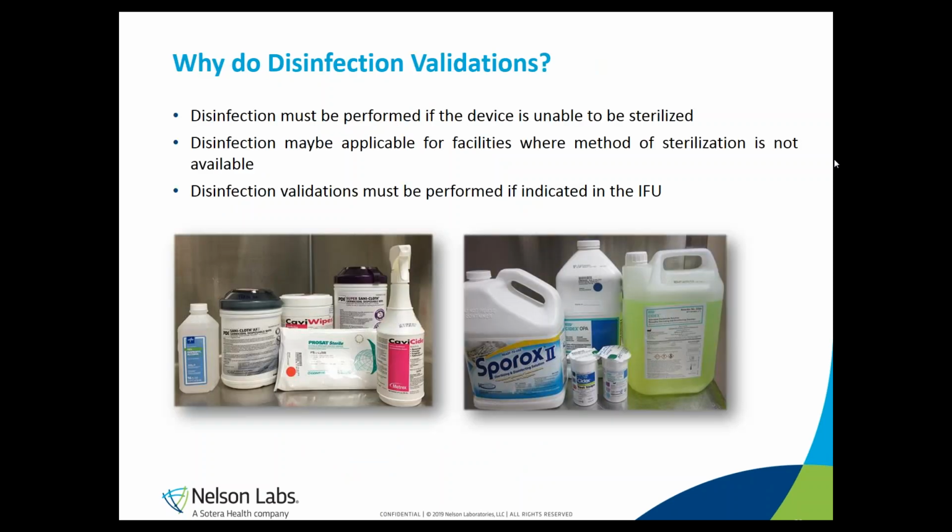Why do disinfection validations? Well, disinfection can be an alternative for sterilization methods if, for example, the device does not withstand common sterilization methods such as steam sterilization. Furthermore, it can be provided as an alternative to those healthcare facilities that do not have access to sterilization methods.